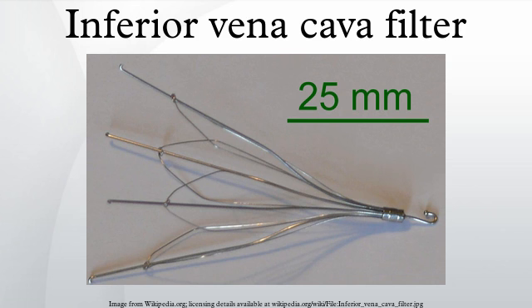Placement: IVC filters are placed endovascularly, meaning that they are inserted via the blood vessels. Historically, IVC filters were placed surgically, but with modern filters that can be compressed into much thinner catheters, access to the venous system can be obtained via the femoral vein, the internal jugular vein or the arm veins with one design. Choice of route depends mainly on the number and location of any blood clot within the venous system.